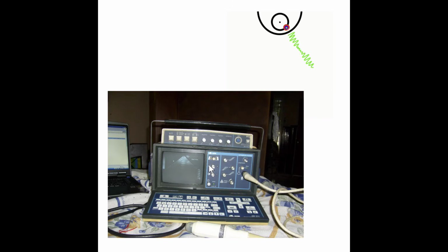On this bottom picture here, we have a very, very old ultrasound machine. It has an annular transducer connected to it here. So again, we can see the casing of the transducer. This is the motor head up here, going to have all that fluid oil coupling material up in the front here. And we can see the picture that is being created here is a sector picture. We've got the pointy top with the wide bottom.